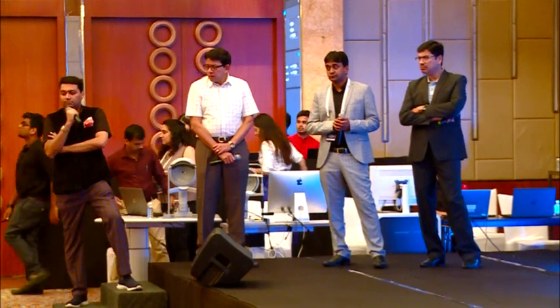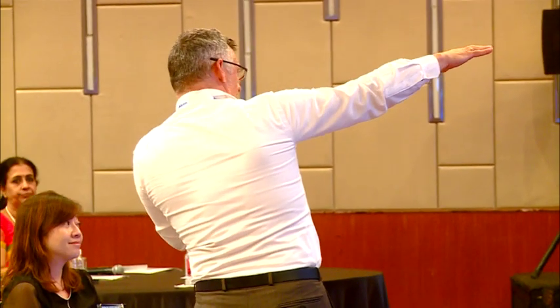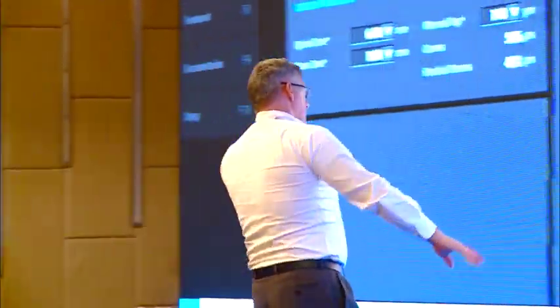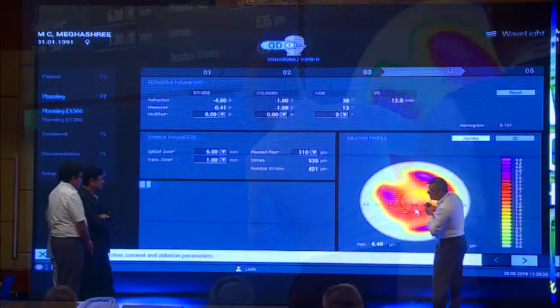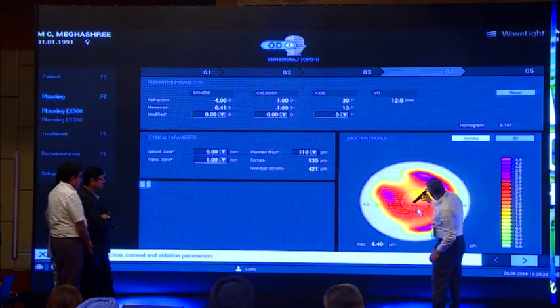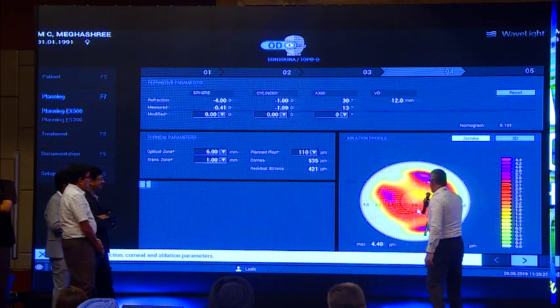The problem with this amount of high order aberrations, or the Zernike polynomials, is that it tells you the amount, but it doesn't tell you the slope. Imagine a mountain that high. The mountain can go slowly, or the mountain can go very deep and hard. And what we have here is a deep and hard dive from this area here. And especially if we go through here, you see that? It's right in the middle of his pupil. Can you get the Fourier? Yeah, you see that?